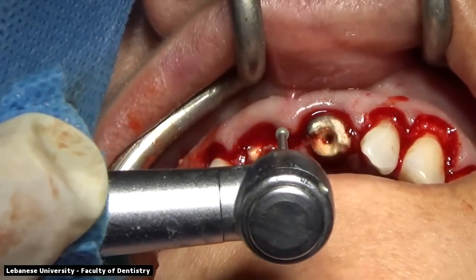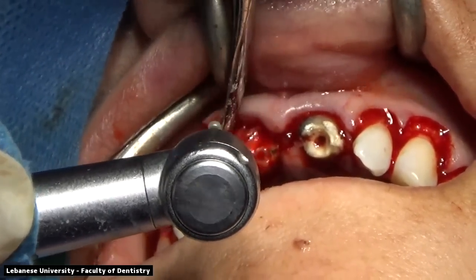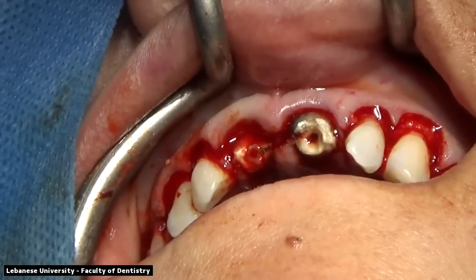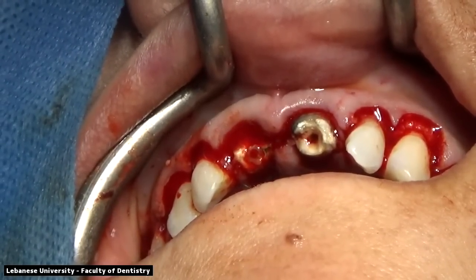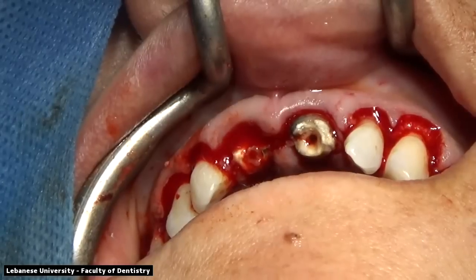There was no ferrule effect for another crown to be made. So both teeth were deemed prosthetically non-restorable. It was decided that they should be removed. The decision was made to remove both central incisors and replace them with immediate implants.